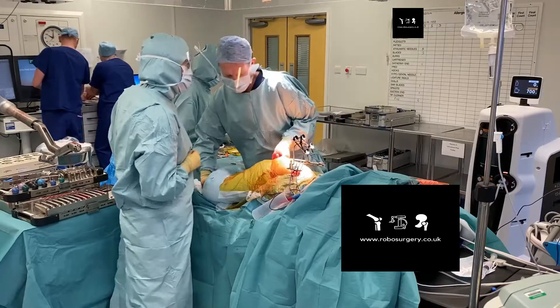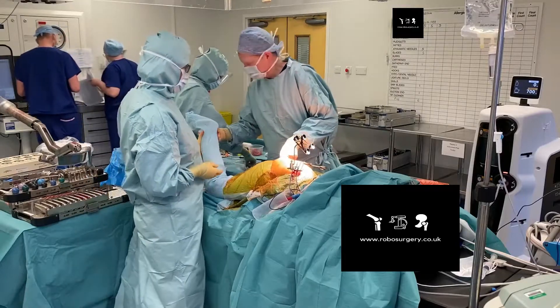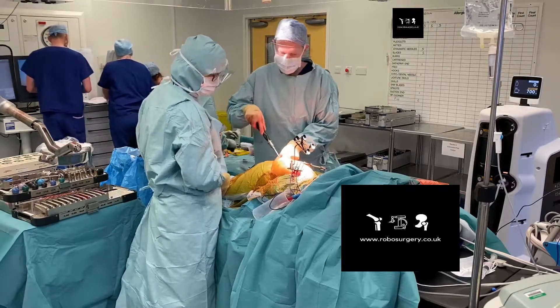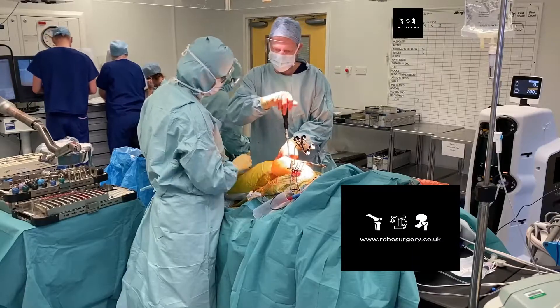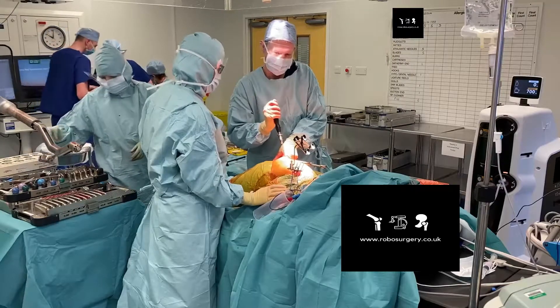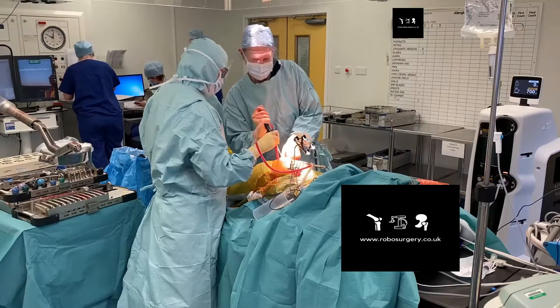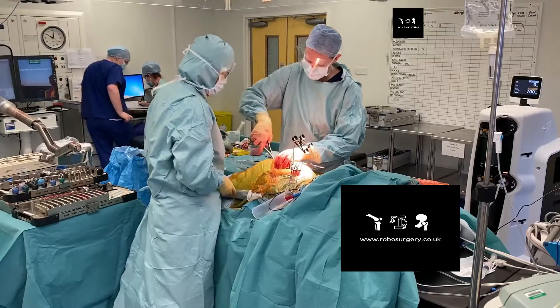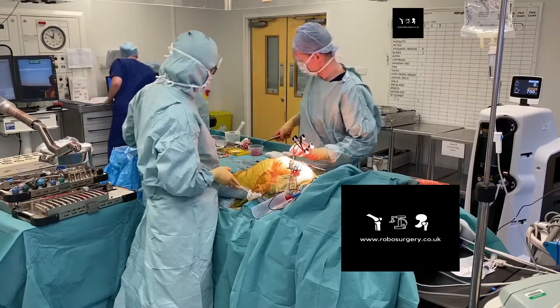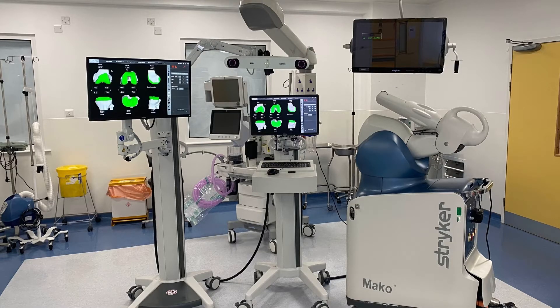We then do a final check using the blue probe at the lateral trochanteric reference point and also on the ECG dot on the lateral aspect of the leg. On the screen it will confirm the offset in millimetres and the leg length. It's important we take out the lateral reference pin and the acetabular reference pin. And that's Mako total hip replacement in a nutshell — thank you.